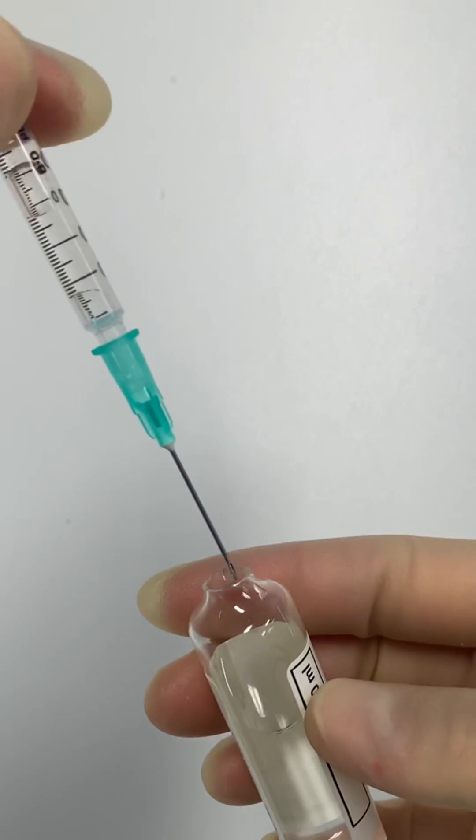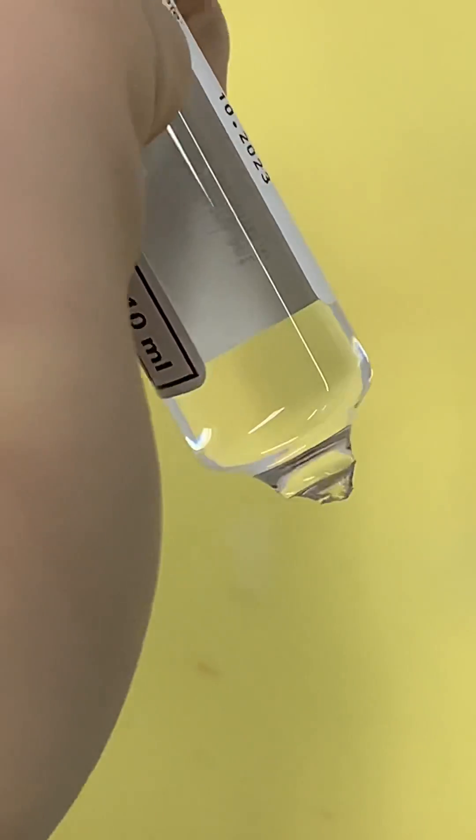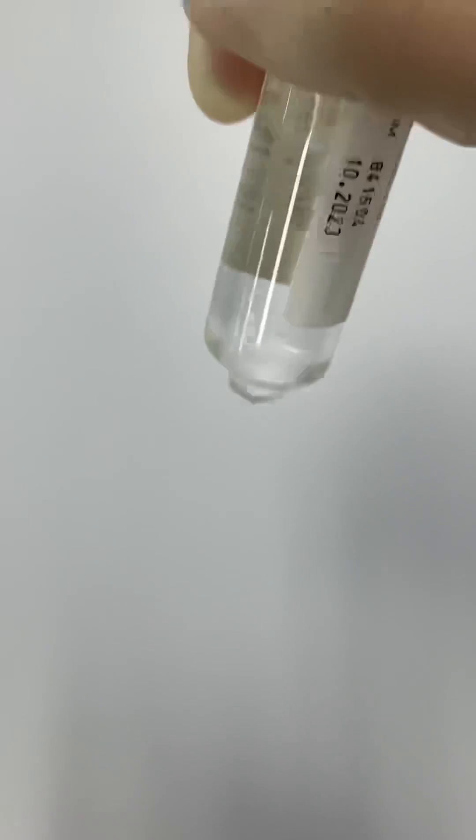If the needle is too short to reach the fluid in the ampoule, you can turn it upside down. And don't worry about spilling the medication because even if you shake the ampoule upside down, nothing will come out.